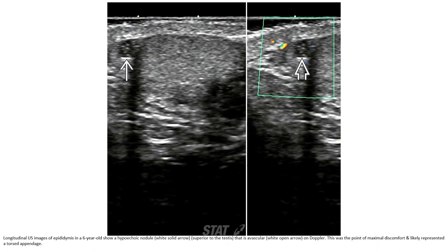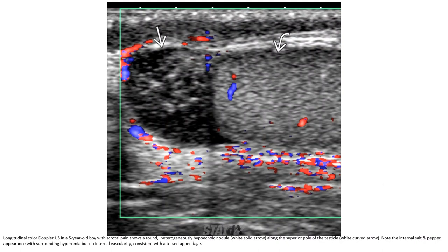Case 2: ultrasound image of the epididymis in a six-year-old shows a hypoechoic nodule with absent vascularity on Doppler. This is at the point of maximal discomfort and is consistent with a torsion appendix. Case 3: a five-year-old boy with scrotal pain shows an avascular hypoechoic nodule along the superior pole of the testicle, with internal striated pattern and surrounding hyperemia but no internal vascularity, consistent with torsion appendix.